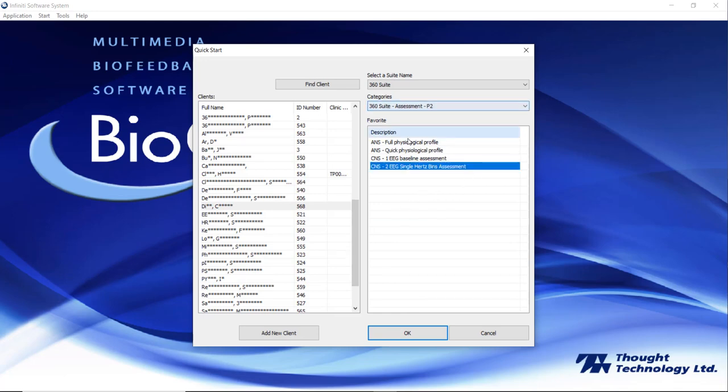Being a ProCom 2 user, I've selected my category. For the actual session, I'm choosing CNS — Central Nervous System 2 EEG Single Hertz Bins Assessment. This is a classic assessment popularized by Michael and Linda Thompson, leaders in the field of neurofeedback. It involves looking at the entire frequency of EEG activity and breaking it down to single hertz bins, so single bars representing two hertz, three hertz, four hertz all the way up to 30-something hertz — a full spectrum of brainwave activity. The session says two EEG, so I could record with two sensors, but I'm choosing only one today as a learning example. The software requires at least one sensor. My equipment is plugged in and the electrodes are on my head, so I'm now going to turn the equipment on. There's a little green light that's appeared — good to go.